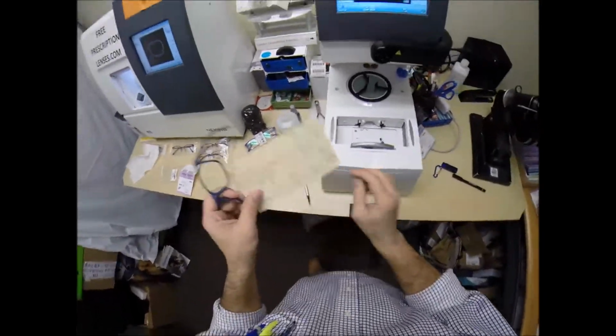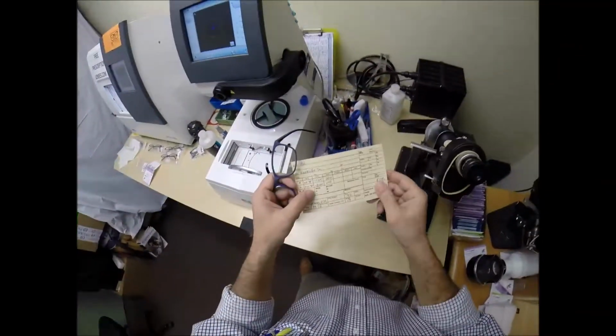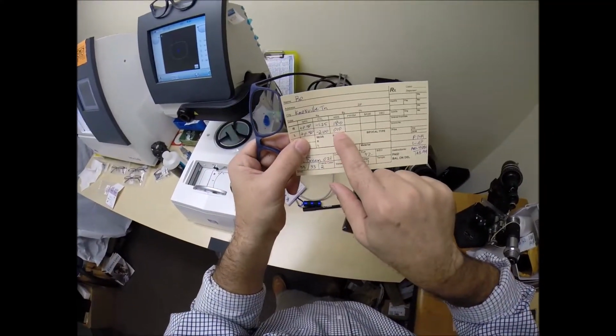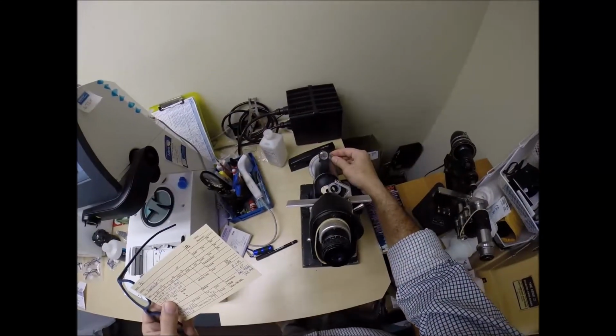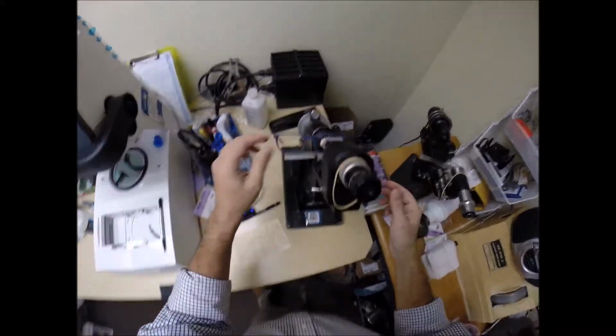We're going to come back down here. Let's clean up a little bit as we go, shall we? I'm going to need that space in just a moment. We're going to spin that fine tune wheel, the astigmatic wheel, to 10. Hello, 10. Yo, man, your left eye's a 10.